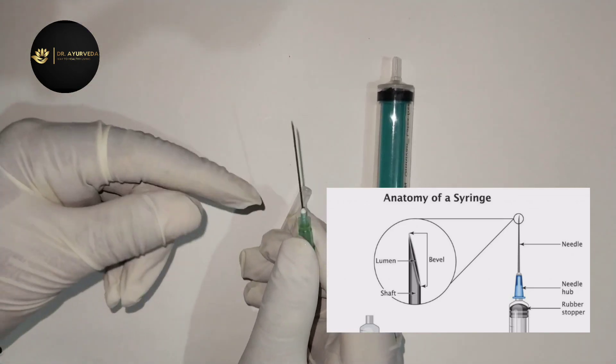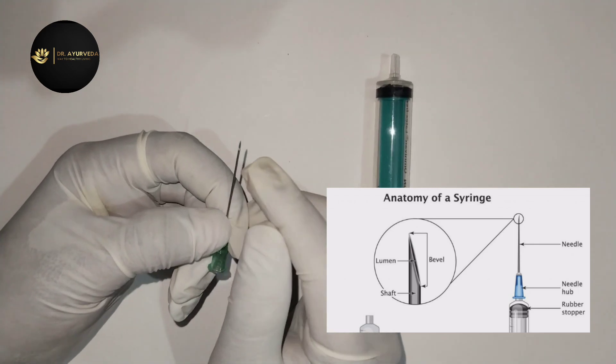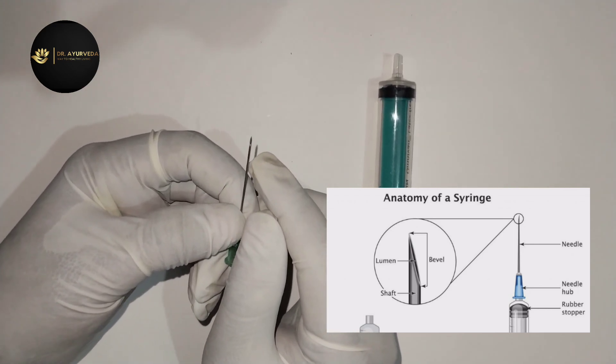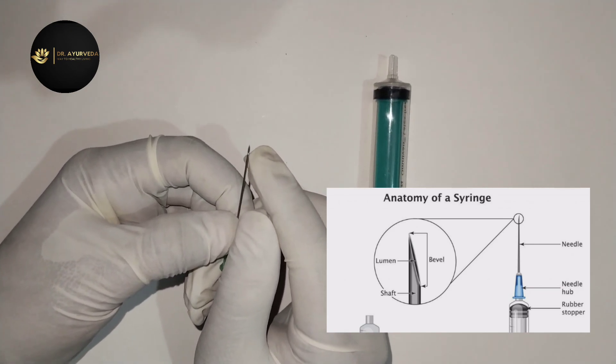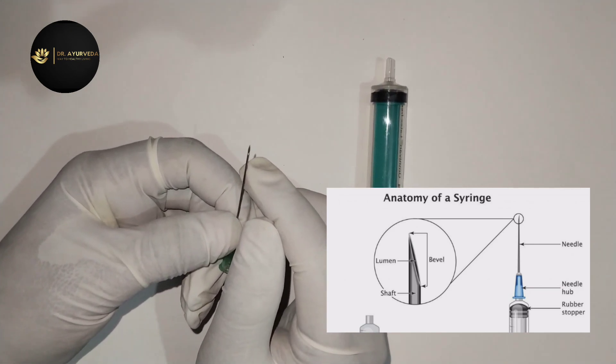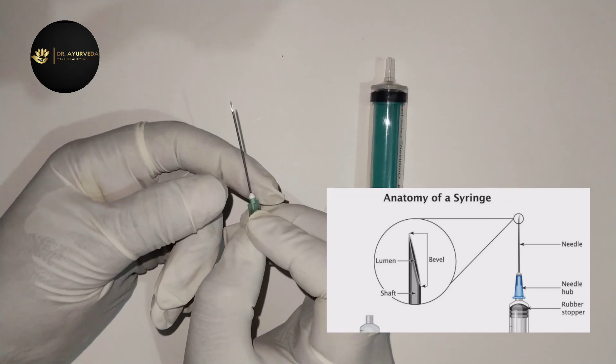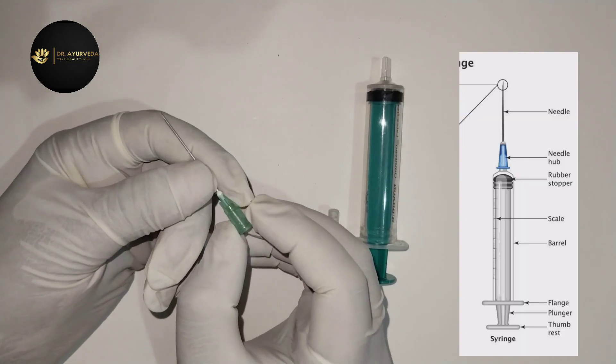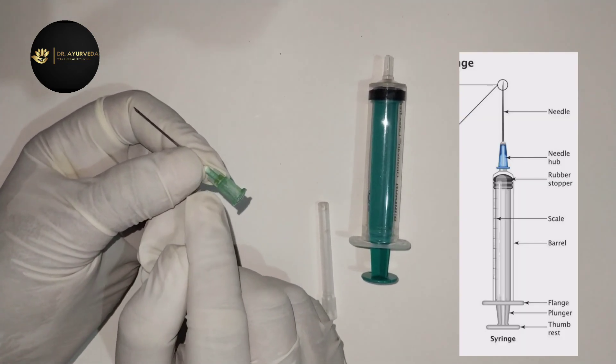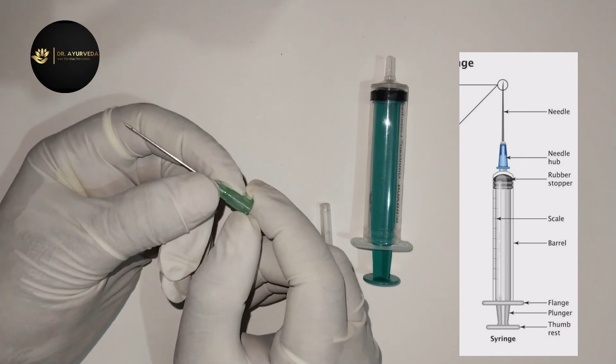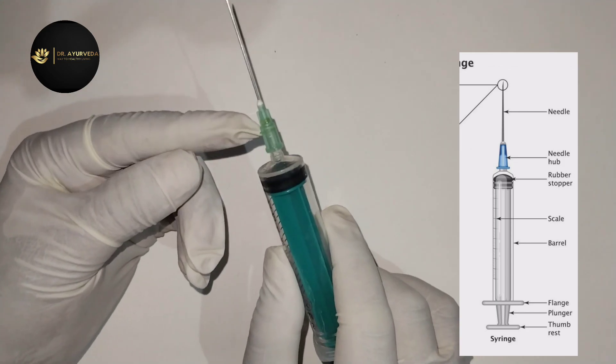Then we have the shaft. Below the cap here is the shaft, here is the bevel, and here is the needle hub.